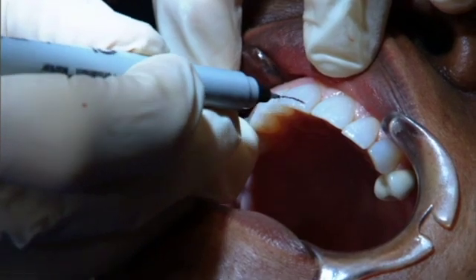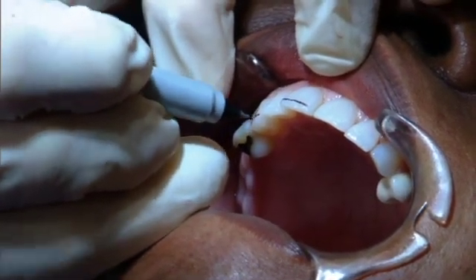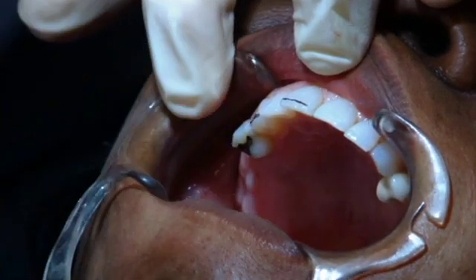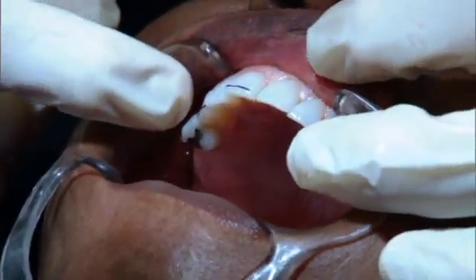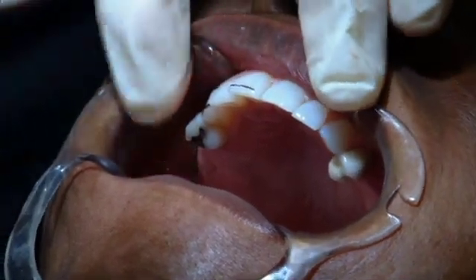One of the things that the lab technicians I work with will tell you is that the thickness of a dime is 1.5 millimeters, and the thickness of a nickel is 2 millimeters. So what we hope to do this afternoon is nickel and dime dentistry. I want to get between 1.5 to 2 millimeters off.